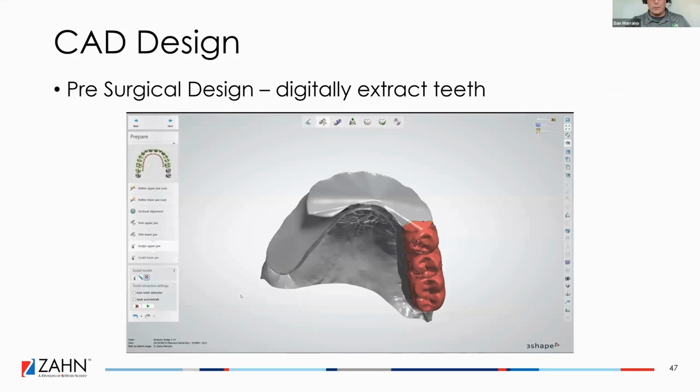And then when we get into design, and I wanted to show this, I had made a video. It was really too long. It was 22 minutes long from start to finish. But if you speed it up, then you're kind of missing some of the important steps. So I did some screenshots here too, so you guys can go back and watch it in the replay.